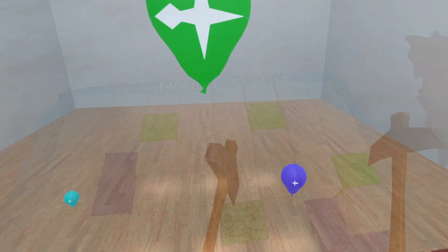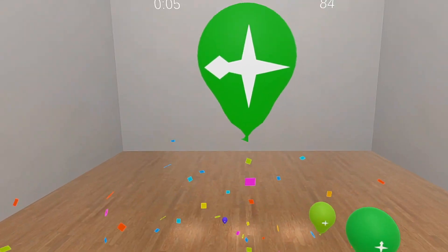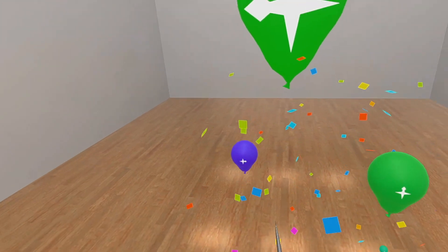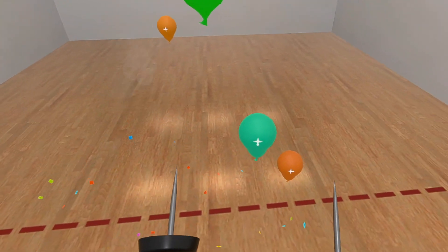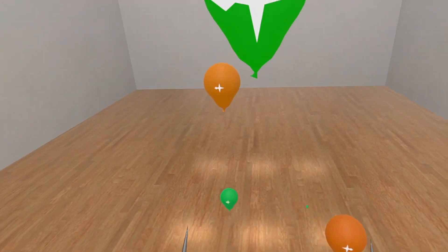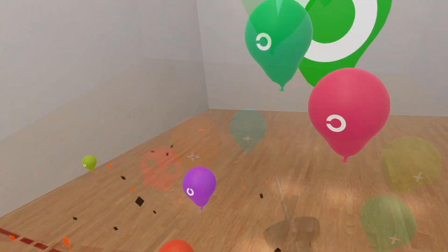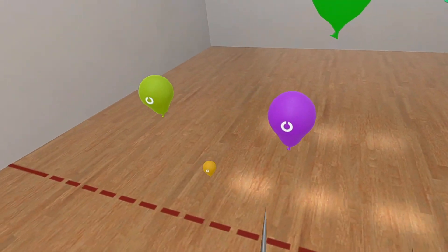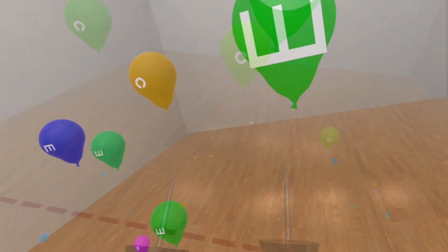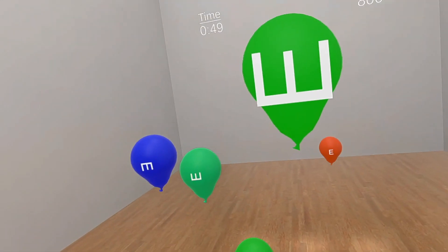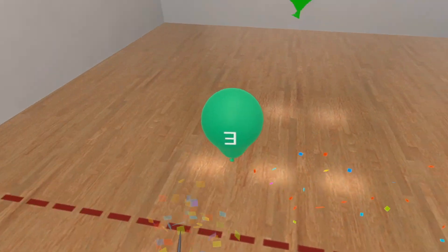Next we have Precision Pop. This is a visual discrimination activity where you need to pop all the balloons that match the same symbol orientation as a large balloon image in the back of the room. The more correct balloons you pop, the harder it gets — balloons will have shorter lifespan. The Easy, Medium and Hard settings will decrease the lifespan of each balloon.